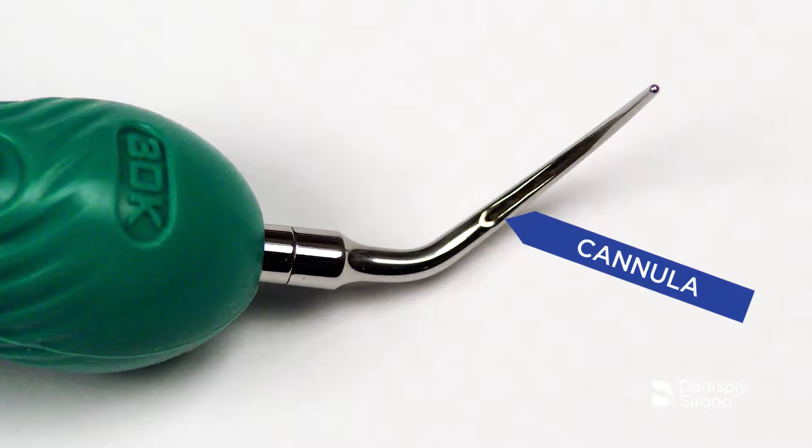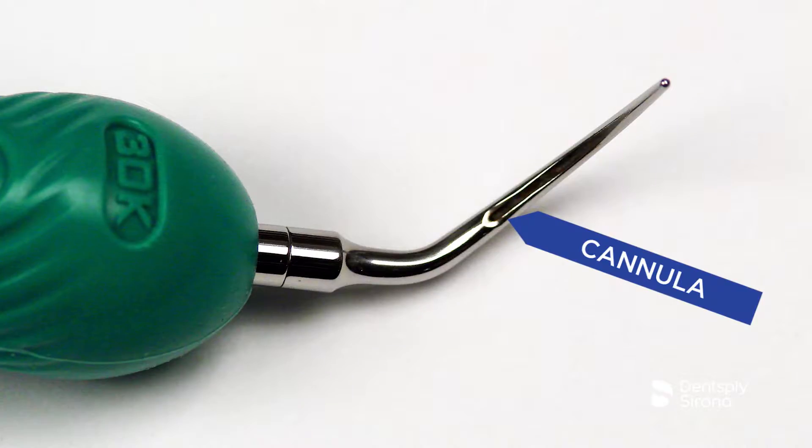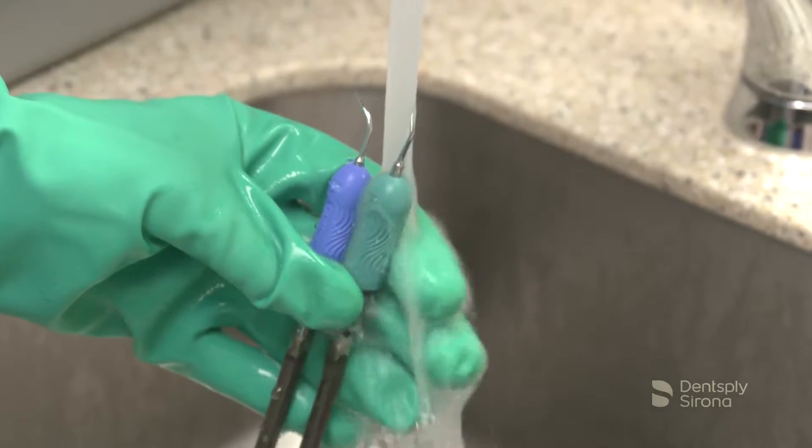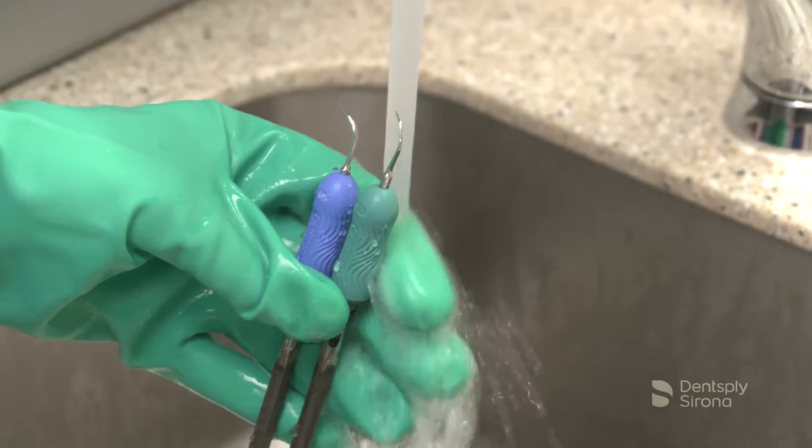Pay special attention to disinfect all holes and cannulas. Rinse the insert under running water for 30 seconds to remove the disinfectant solution. A disposable syringe may be used to rinse the holes and cannulas.